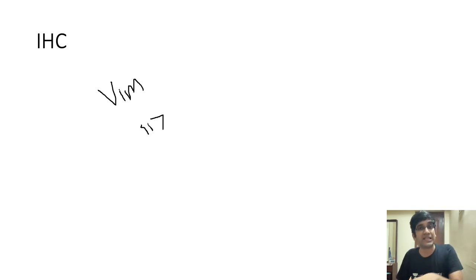It's not the diffuse positivity which is going to give me a clue. If there is rhabdomyoblastic differentiation, the rhabdomyoblastic markers might be positive, right? I want you to remember, again, it should be focal. The only one which can be diffuse is my vimentin. And if there are any epithelial components, they can be cytokeratin positive. EMA should be negative in this tumor, fine?